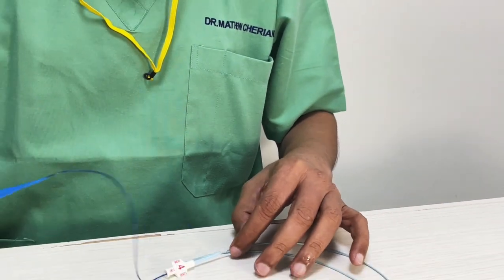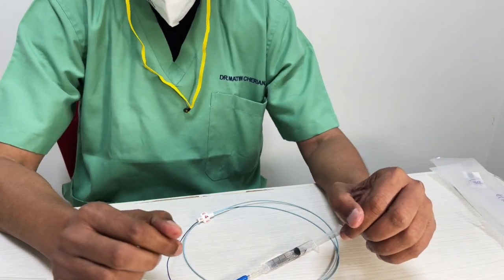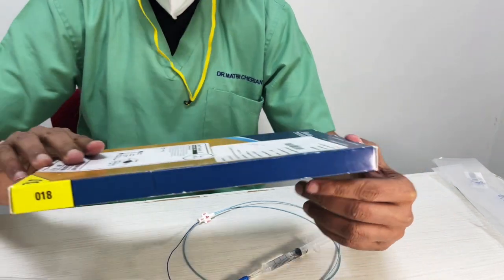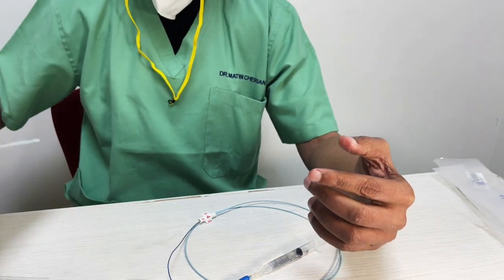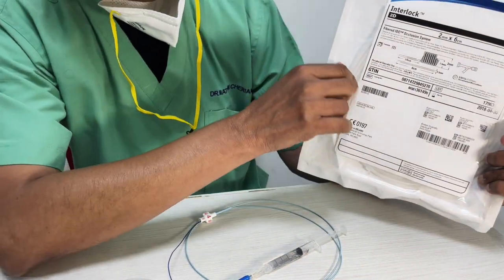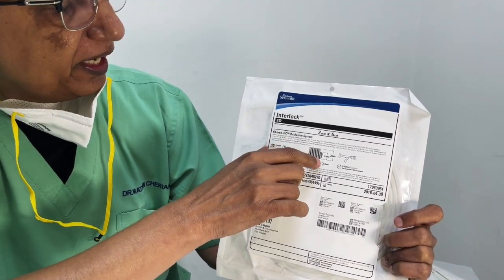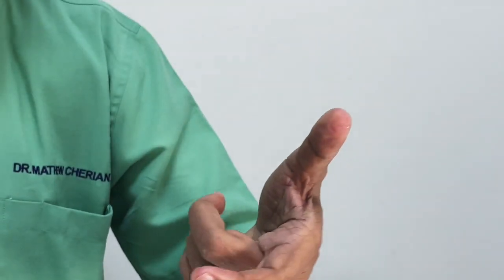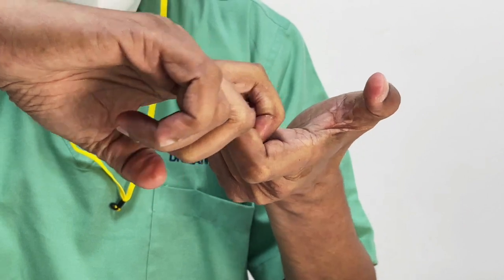So in the periphery, do we have a detachable coil system at all? So the only coil system that we have which is detachable is called the interlock coil. Yeah, this is an interlock coil, very similar, except the small differences. They have got a system which is like a latch like this. So imagine you've got a latch that is like this. It's very similar to this.